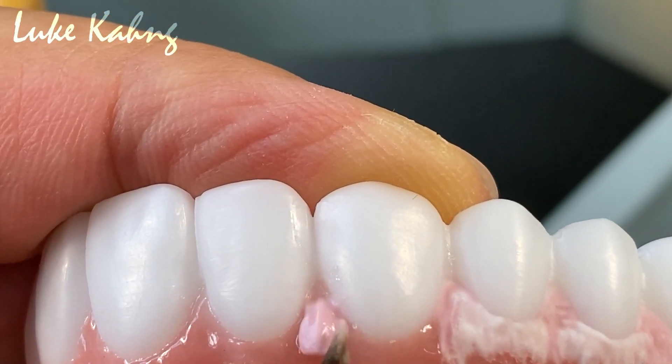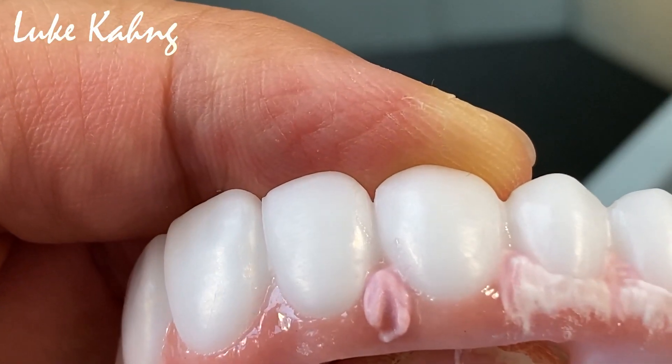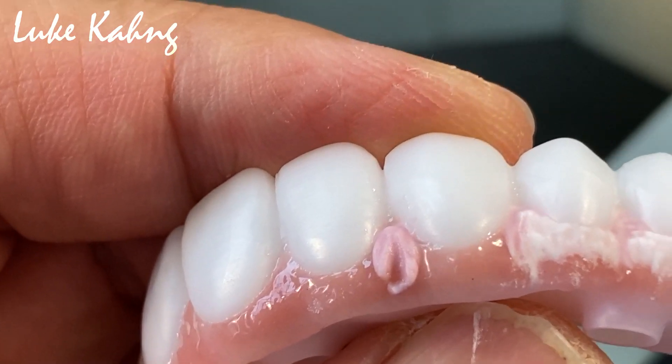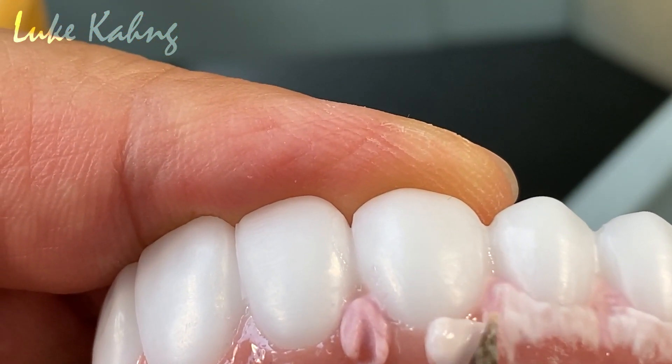That area is a more darker color, and then the rest — to make a more brighter color, but not to make it look bad.